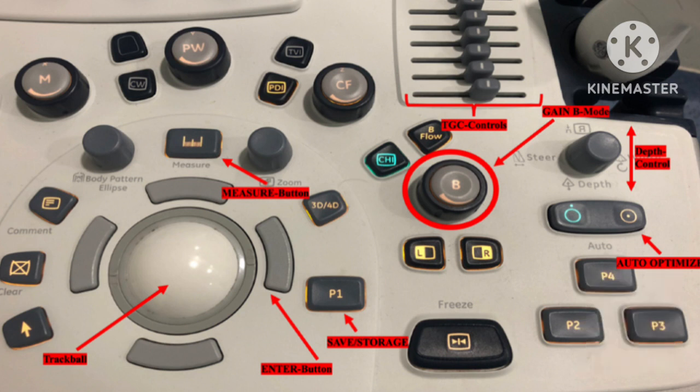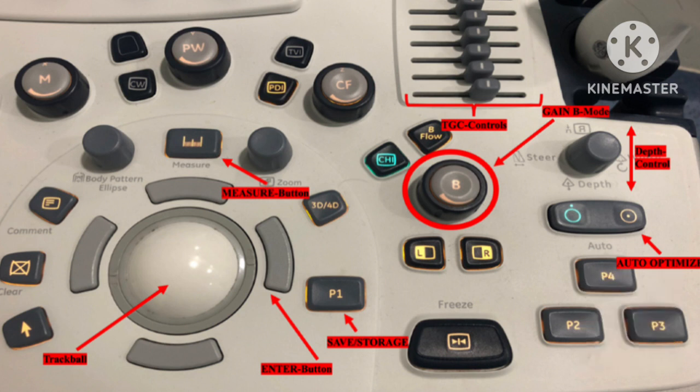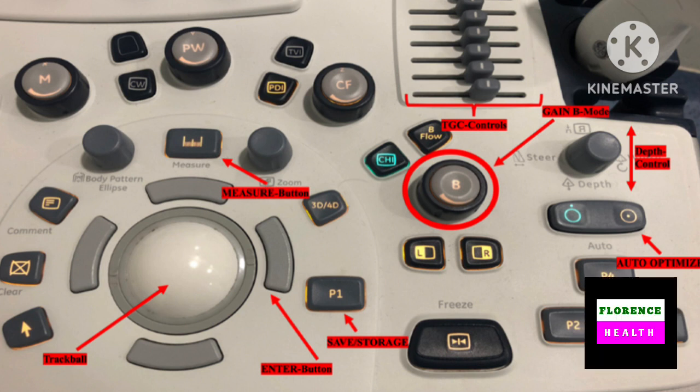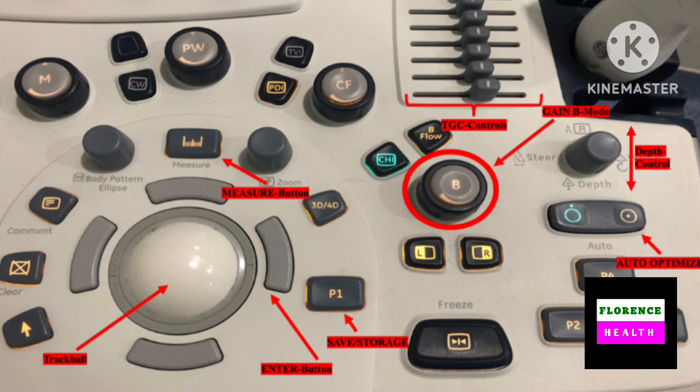That's why first you should know about the knobs, about the machine, then you go for sono examination. Without knowing about the knobs and the machine, you should not go for sono examination of any organ or any part of the body.